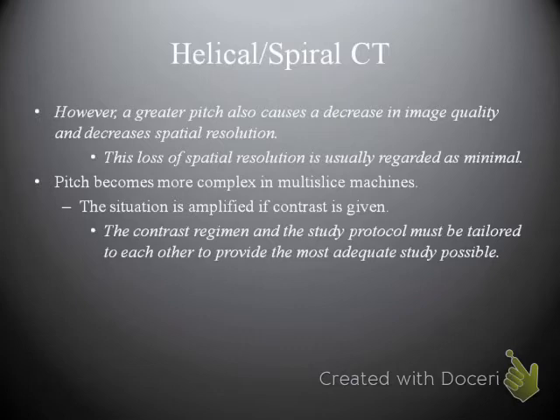For those of you who are in physics, spatial resolution should come up on this lecture as well. And we define spatial resolution as the ability to image very small things. Could be small things such as stranding in the mesentery due to an inflammation, a fluid level, a rupture, a small amount of air somewhere, or a very small nodule in the lungs. Things like this are what we need great spatial resolution for.